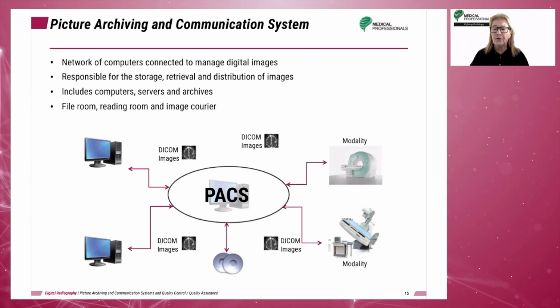Johnston and Faber describe the PACS as an integral part of the radiology department today. The PACS provides a method for communication between the imaging modalities and the storage and retrieval systems of the radiology departments. In addition, radiologist reading stations allow the radiologist to perform post-processing manipulation and enhancements of the images that they are interpreting.